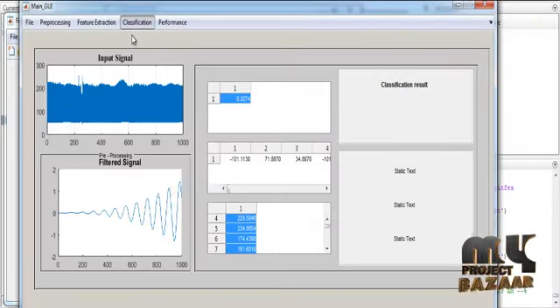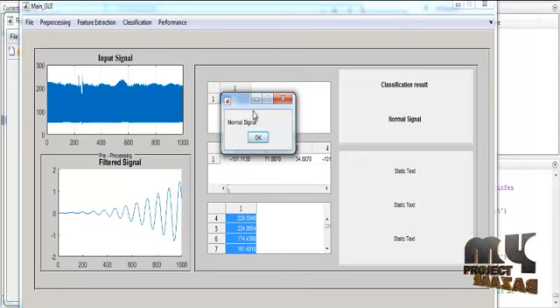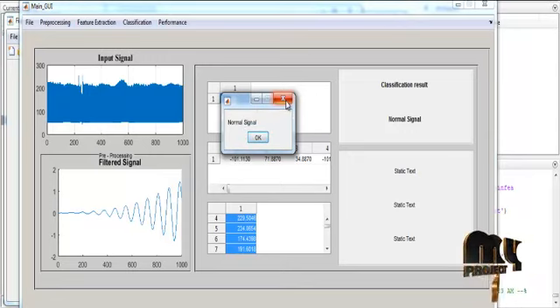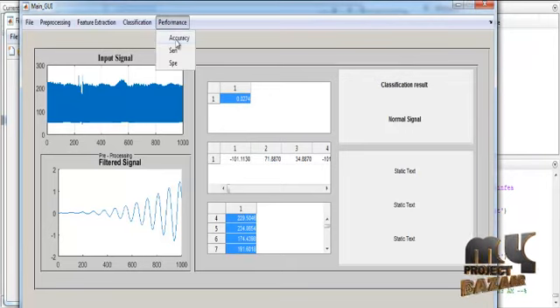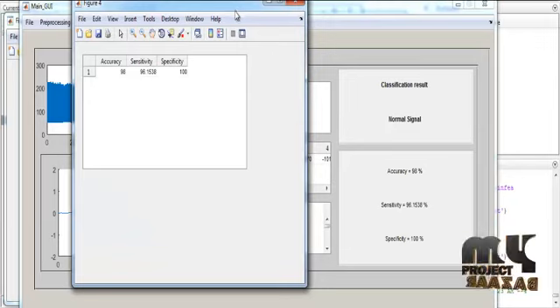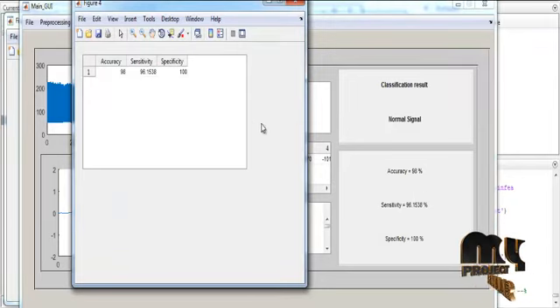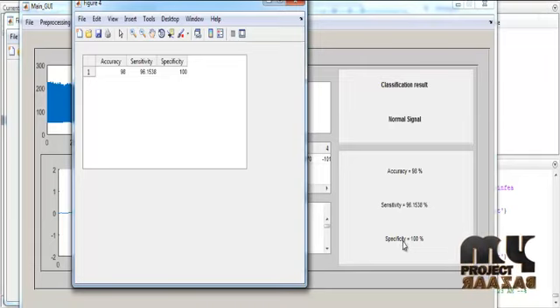After feature extraction, feature classification is performed. The classification determines whether the input signal is normal or abnormal, and the result is displayed. Then accuracy, sensitivity, and specificity values are calculated and tabulated. For example, if accuracy is 98%, it will be displayed as such, followed by sensitivity and specificity values.